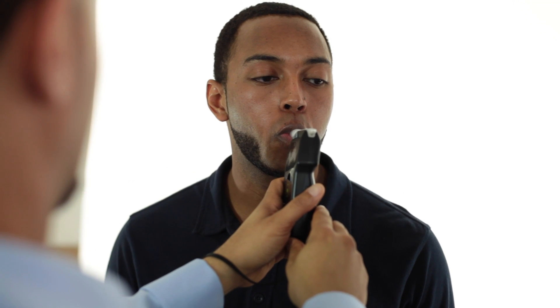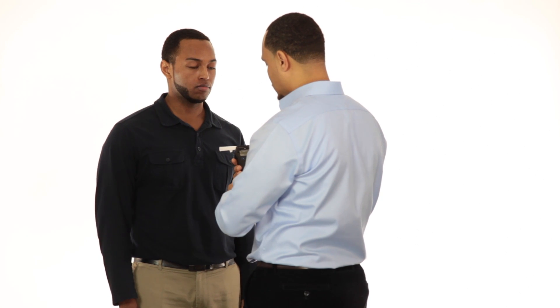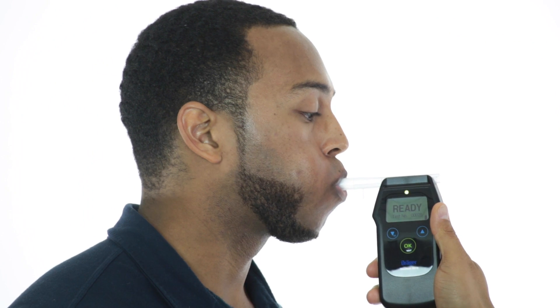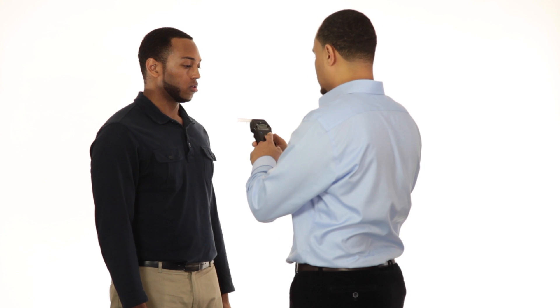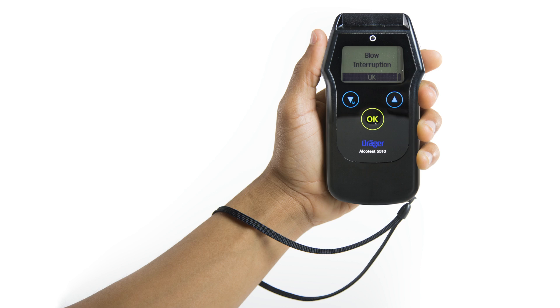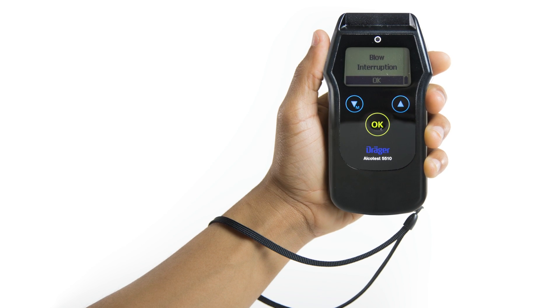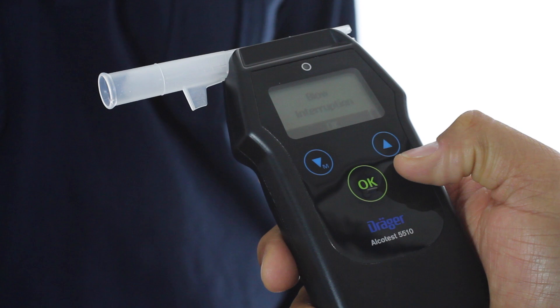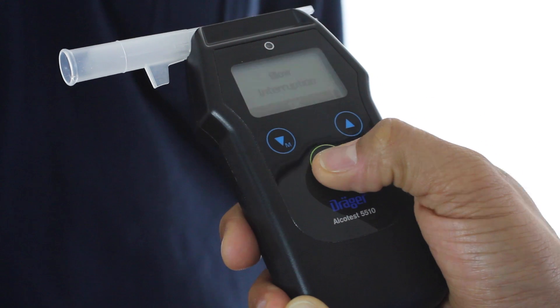A standard sufficient breath sample is defined as when a subject has blown at least 1.2 liters of air for at least 2 seconds. If a sufficient breath sample is not provided, one of two errors will occur. If an insufficient volume error occurs, the device will beep, the LED light will flash red, and the screen will indicate 'insufficient volume.' This error occurs if the subject did not blow continuously or the breath volume is too low. If a blow interruption error occurs, the device will beep, the LED light will flash red, and the display screen will indicate 'blow interruption.' This will occur if the subject exhales improperly by abruptly stopping or sucking air back before the end of the blowing period. To exit the error screen and re-administer the test, press OK.